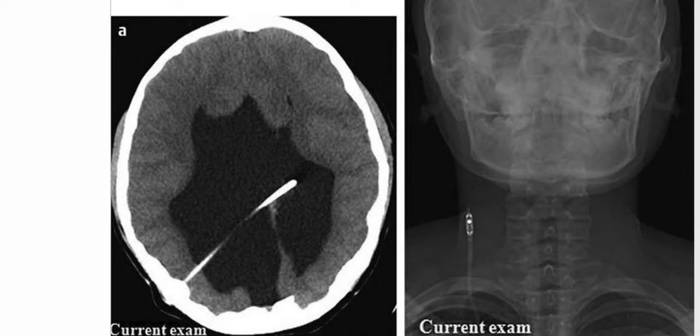A right posterior approach ventricular drainage catheter is also noted, and the frontal radiograph of the skull and neck from a shunt series shows discontinuity of the VP shunt within the soft tissues of the neck on the right side. So the key finding here is interval dilatation of the ventricles and clinical decline in a patient with a VP shunt. So the diagnosis here is shunt catheter malfunction.